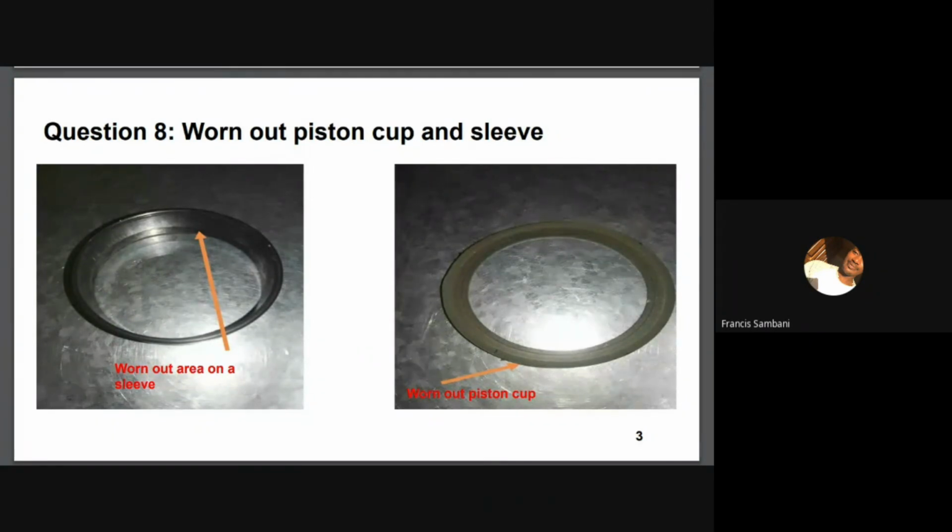After you fix this, you're supposed to put everything back together. You remove the hex plug, put back the relief valve, and then test the performance of the concentrator at the maximum flow. It should be noted that every time you're trying to assess a concentrator, you should assess it at the maximum rated flow. So if it's a 10-liter oxygen concentrator, you test it at 10 liters. If it's a 5-liter, like this one, you test it at 5 liters per minute.